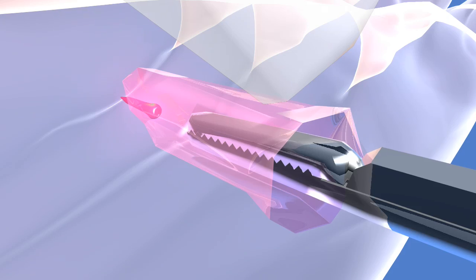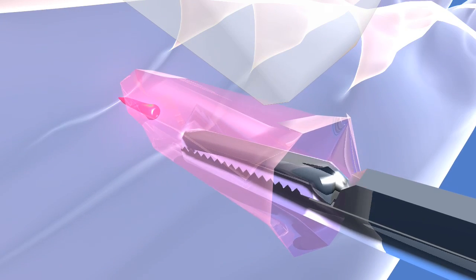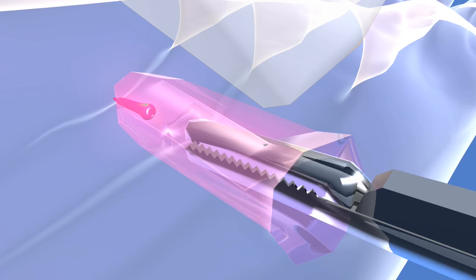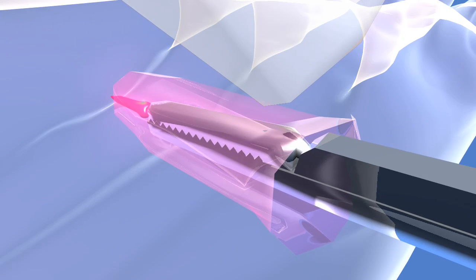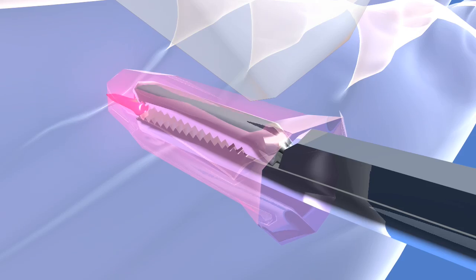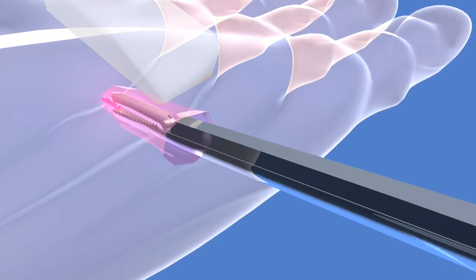In this minimally invasive technique, wood that is not visible under x-ray evaluation is removed with ultrasound guidance, with the sound beam striking the wood as a solid object and making it well demonstrated with sonographic illustration.